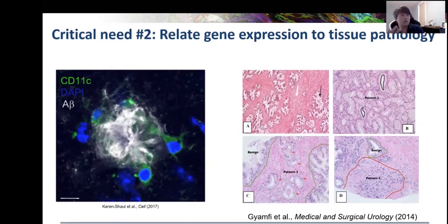For example, here on the right, in cancer, pathologists can look at different patterns of cells which are chromogenically stained, just stained with a couple of different colors, labeling the structures, and you can start to identify patterns which predict the characteristics of disease. However, we started to understand the molecular mechanisms perhaps behind, for example, different types of tumors, and we really would like to connect that with our pathological or morphological understanding of pathology, and then we might be able to learn, when you have a certain pathological pattern, what are the underlying molecular mechanisms.